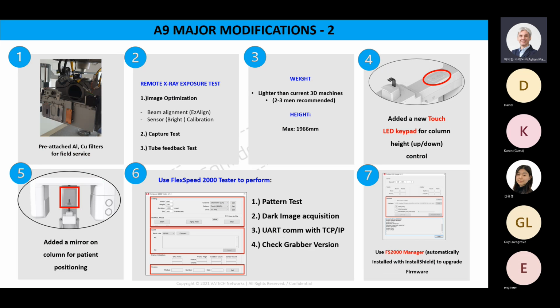And also in the second slide, you can see that we pre-attached the aluminum and copper filters to the device, because sometimes service engineers may forget to take these with them to the site.